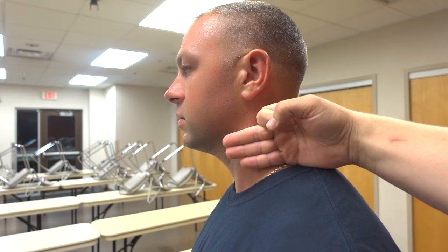For major trauma or if the patient is obtunded, hold manual c-spine. When sizing a c-collar, start with the head in neutral alignment. Measure from the top of the shoulder to the base of the chin.